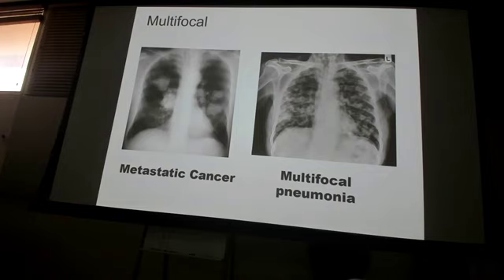And when you pull up these x-rays digitally, you'll have little measuring tools and everything on there. And then here you're seeing that too, multifocal pneumonia. So what is this? Think it's bacterial? Or viral, fungal? It could be bacterial, but most likely it's going to be viral.